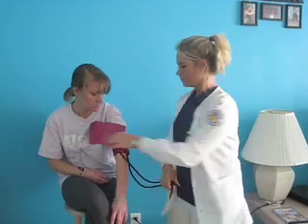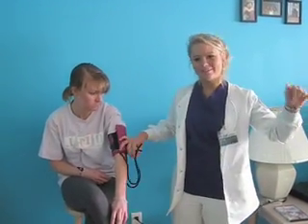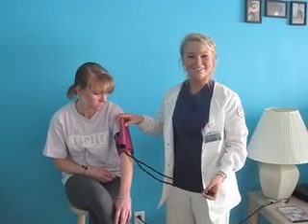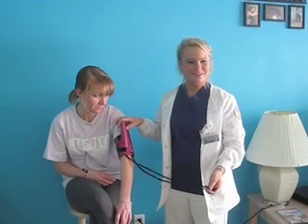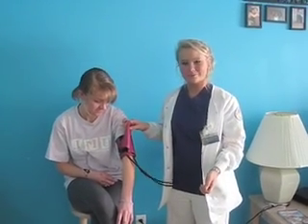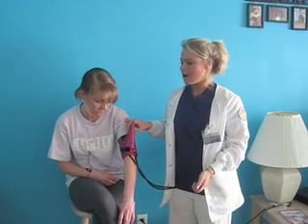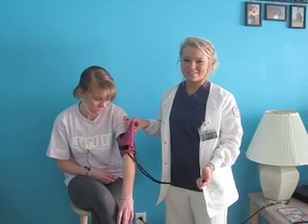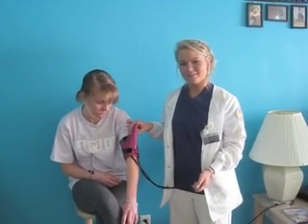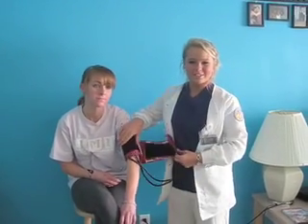You press on, turn on the machine, then you're going to press inflate, and as the cuff inflates, you patiently await, and it'll beep, and it'll tell me what your blood pressure is, and the normal range is 120/80, so anything that's relatively within that area is great. Also, check with your individual patient status and their previous history with blood pressures, like if they have hypotension or hypertension, and see if it's within their normal limits, and if not, call a physician.